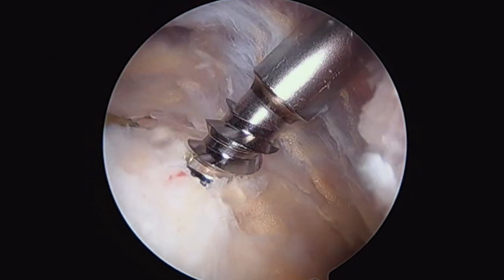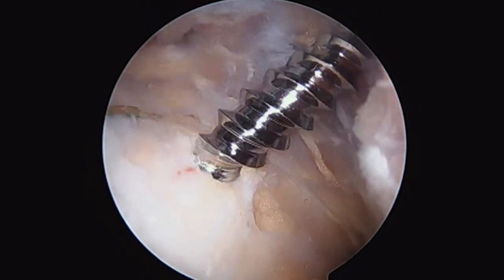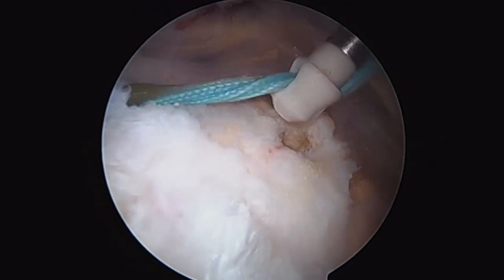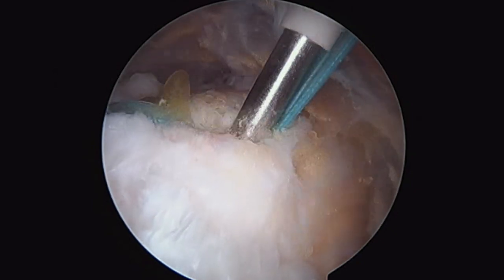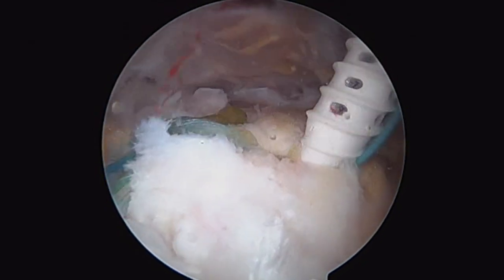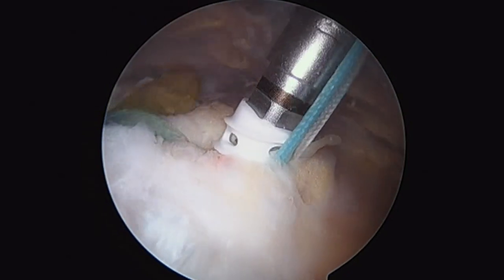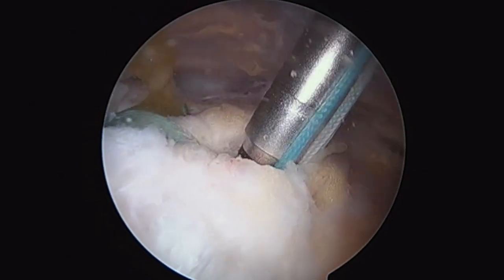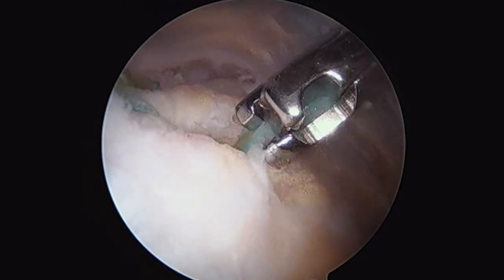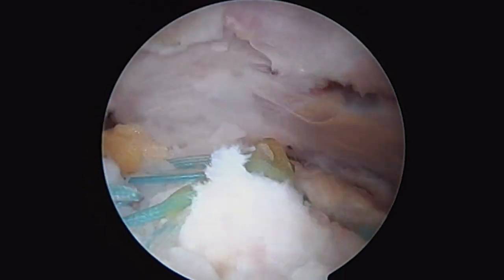This is the tap again for our posterior lateral row anchor. It creates threads for the actual anchor. There's our anchor coming in. Take tension off, find our hole, drop it in there, check our tension — that looks pretty good. The last thing is we cut our suture flush. And then we have a look at our repair.